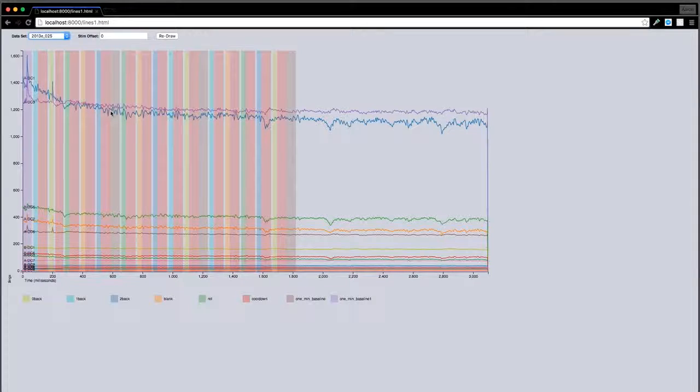And basically what you're seeing here is each of these lines is related to one of the sensors that a participant was wearing when they completed a set of test activities. And the next thing is you have these vertical bars. And so these vertical bars show the time periods of different stimulus activities that those test subjects were participating in.